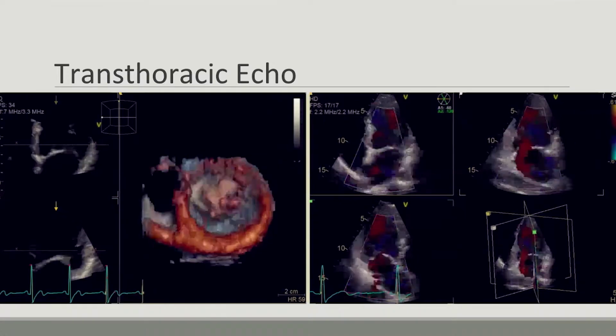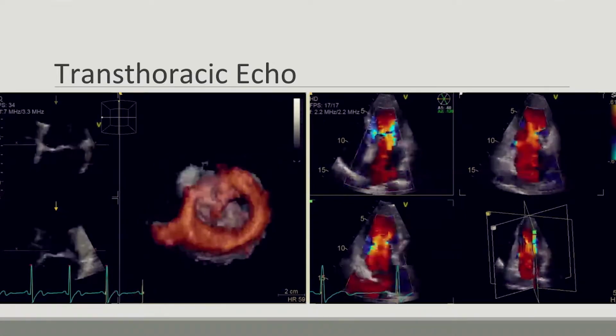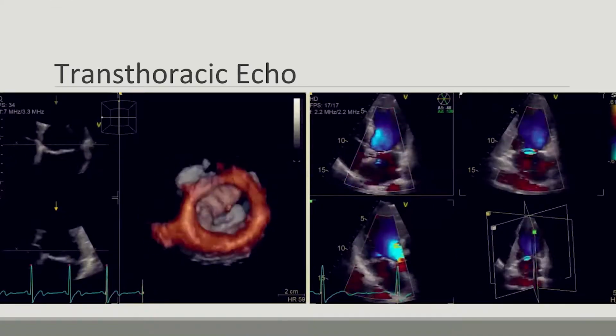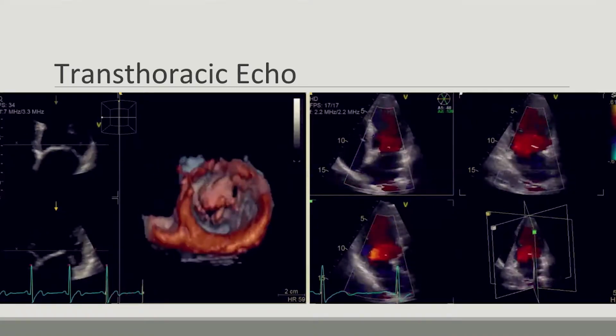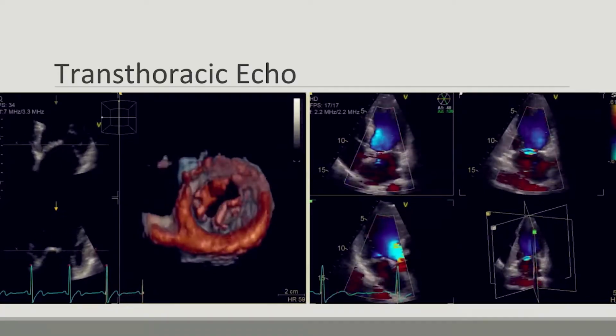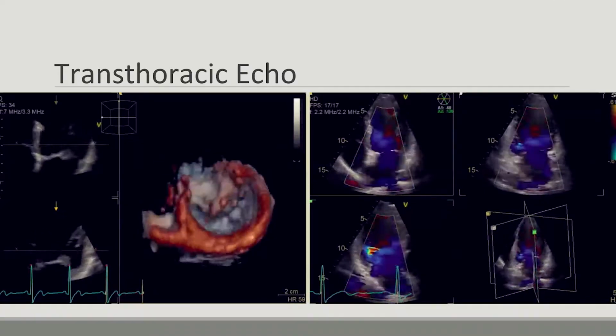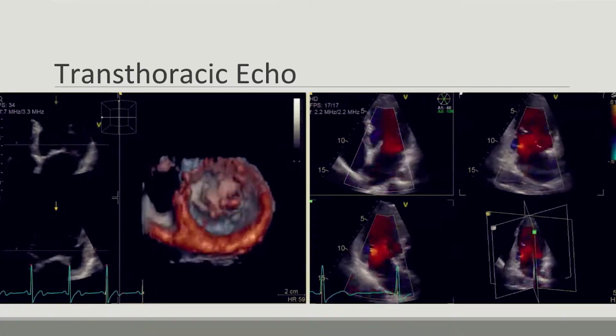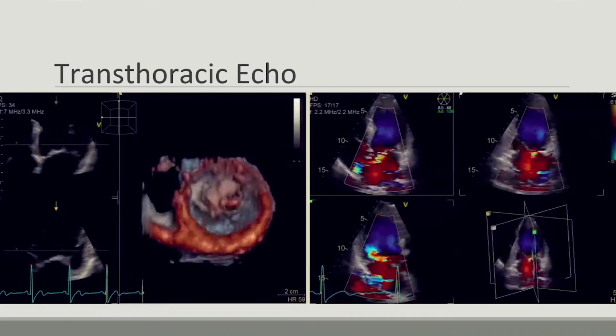3D and biplane or triplane imaging can also be really useful to visualize these valves, if that is available at your institution. The image on the left is a cropped 3D image of the mitral valve, showing the prolapse beautifully. The image on the right is using triplane to look at the eccentric jet. This can also be used to see PISA in all three views at once.